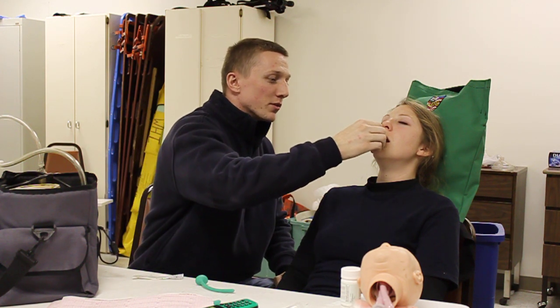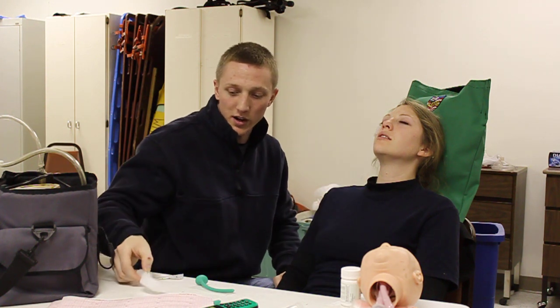Your patient is gagging and becoming conscious. I'm going to go ahead and remove the OPA, following the natural curvature of the mouth.